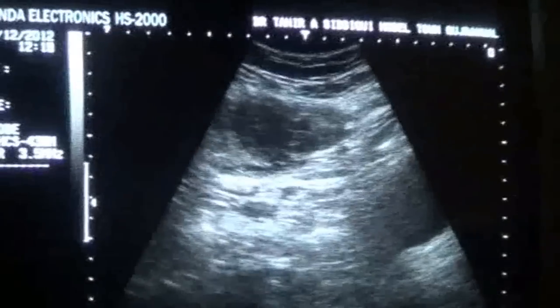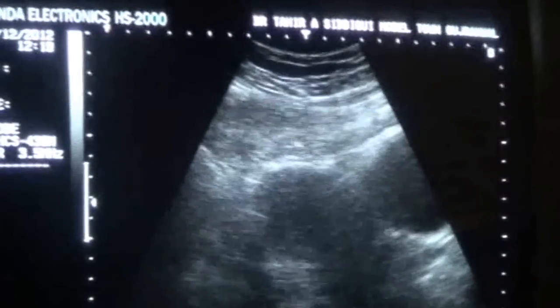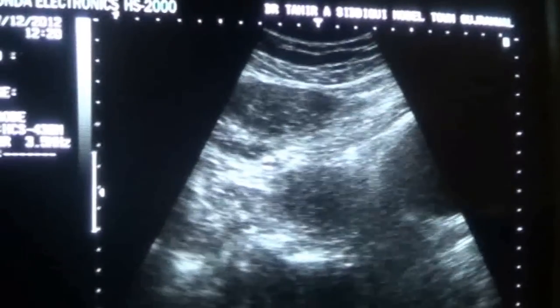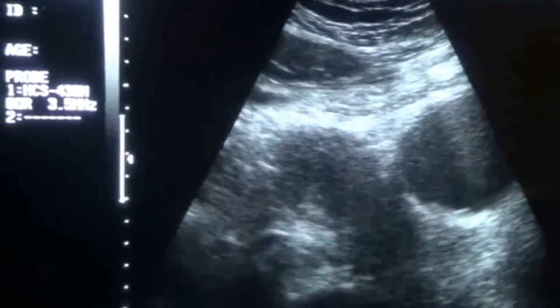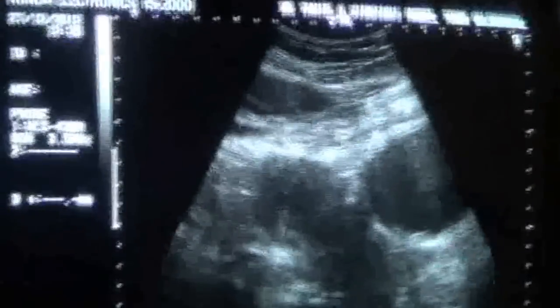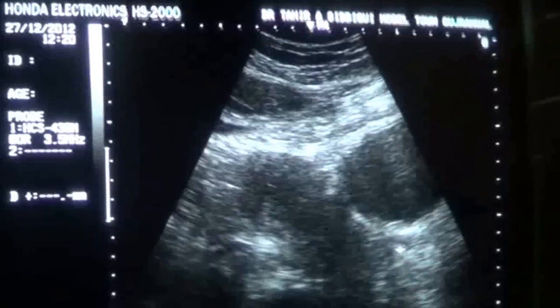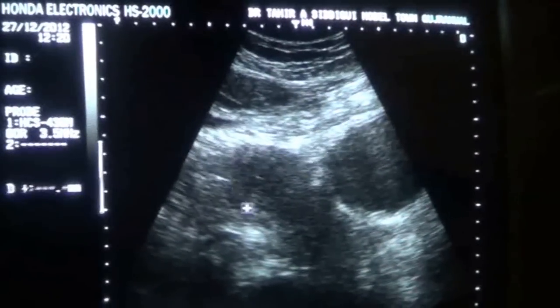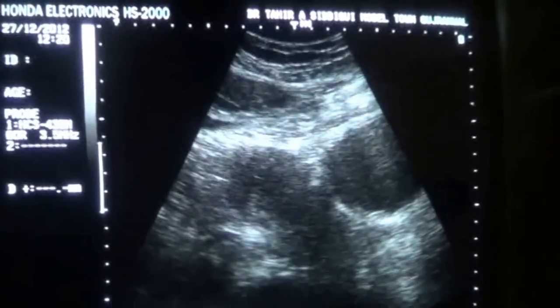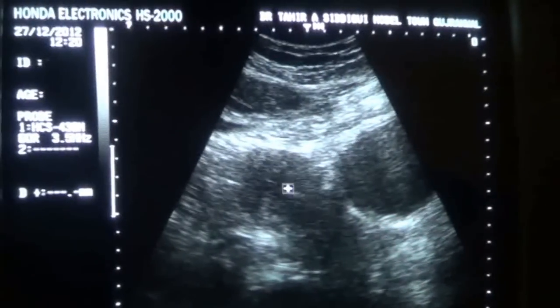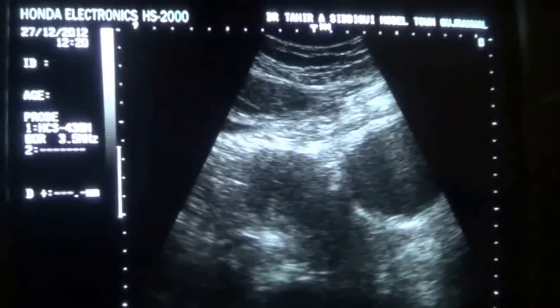It is tender in this region, and you can see that with a partially filled urinary bladder. This is the urinary bladder in longitudinal section, this is the uterus, uterine outline, the anterior myometrium, and the posterior endometrial canal.